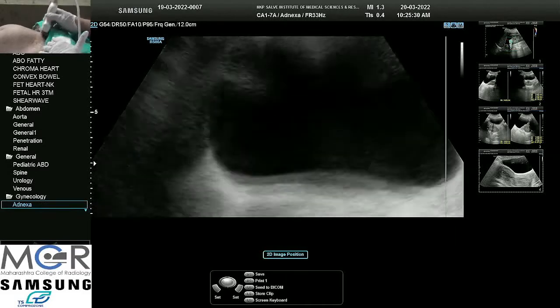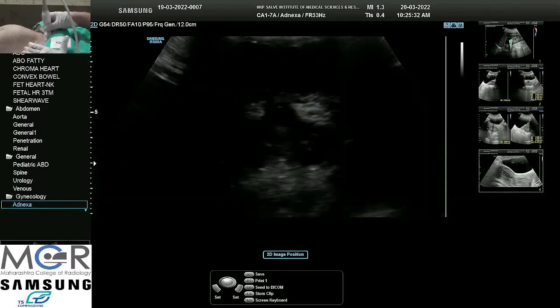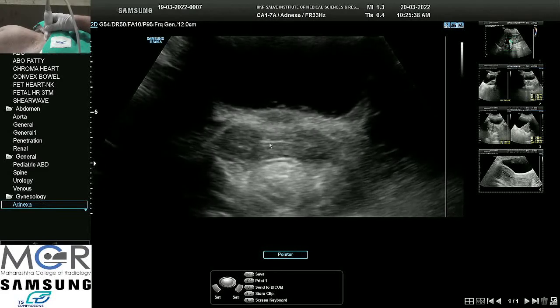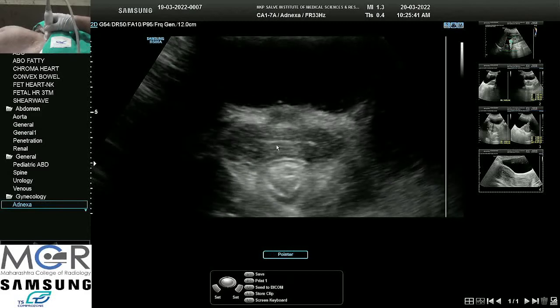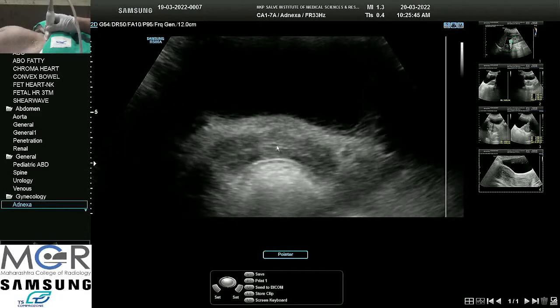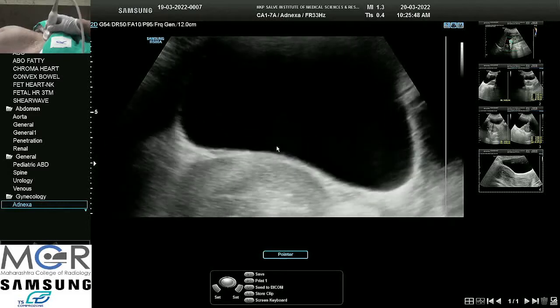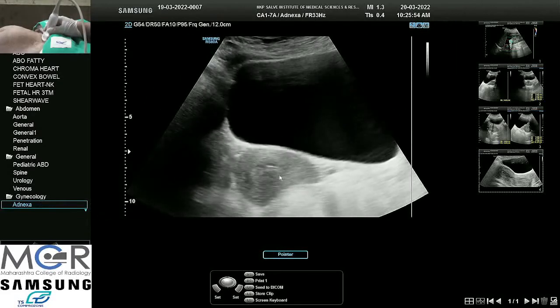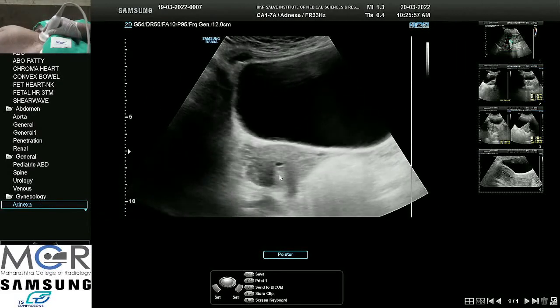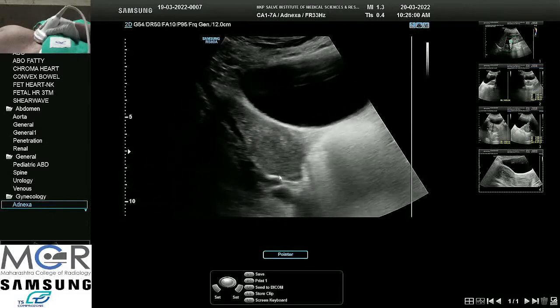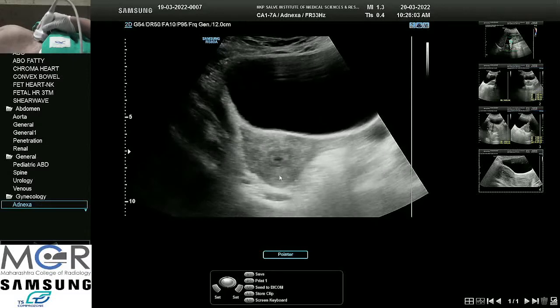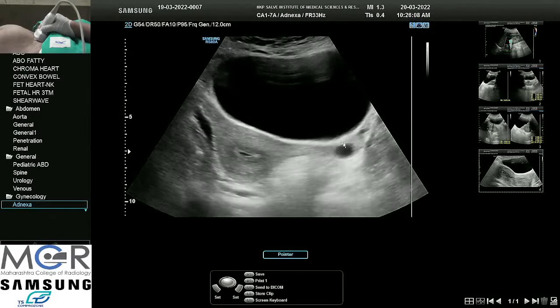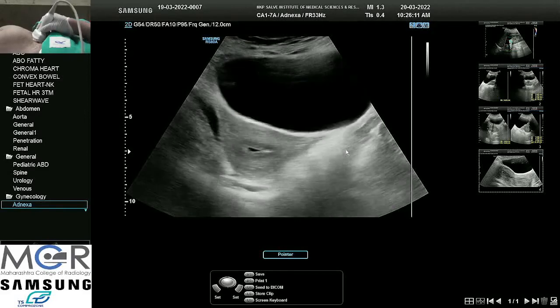After placing the probe on the pubic symphysis, we first try to see the vagina. This white line which we can see here is the vagina. From here we take an upward sweep so that we come into the cervix area, and we go further ahead to see the fundus. This is the transverse scan we are seeing. We can see the left ovary coming up very nicely — this is the anechoic area which is the follicle, which may be a growing follicle.